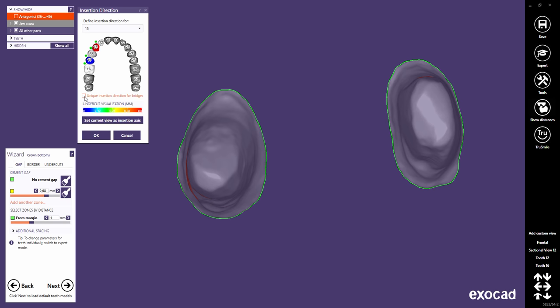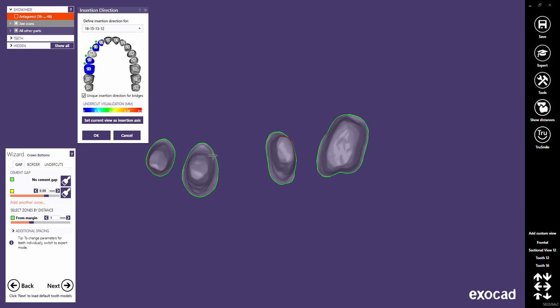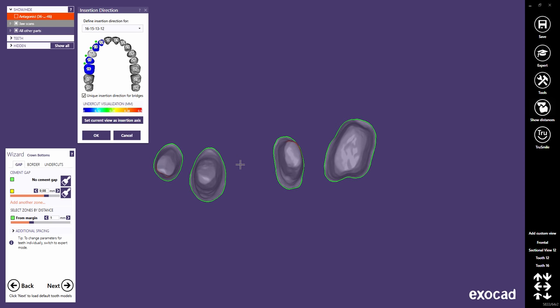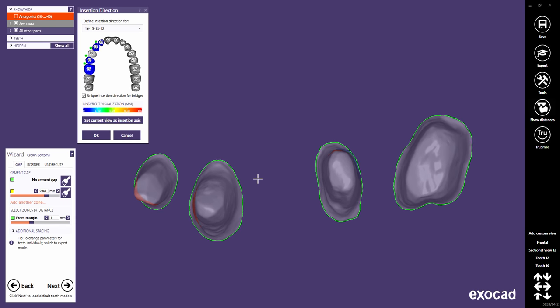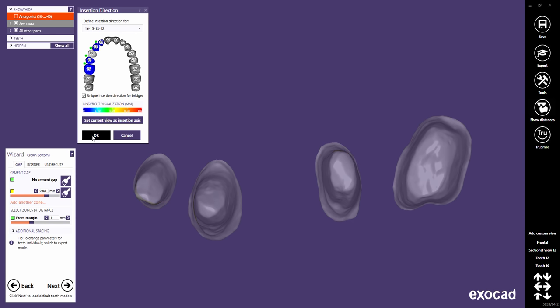Check 'Unique Insertion Direction for Bridges' to choose a unique insertion axis for all connected crowns. Note that the software will automatically enforce parallel insertion axes for bridges if a material configuration for 3-axis or 4-axis milling is used. Now let's choose a unique insertion axis for the bridge and click the OK button to apply the changes to the crown bottoms.